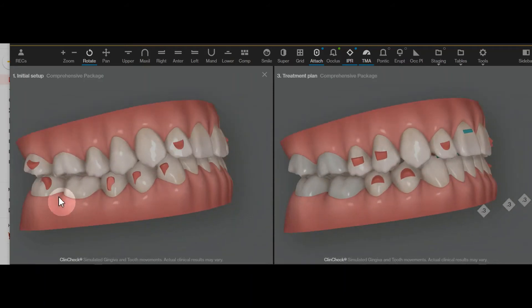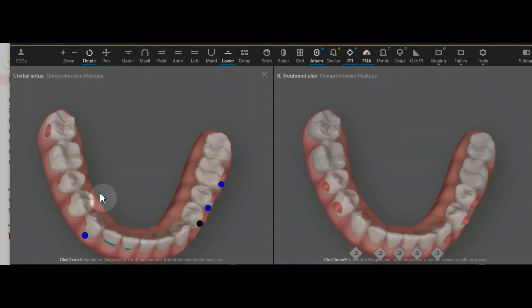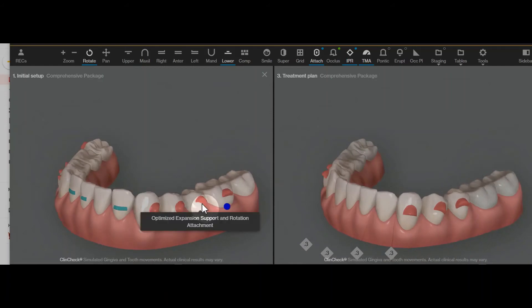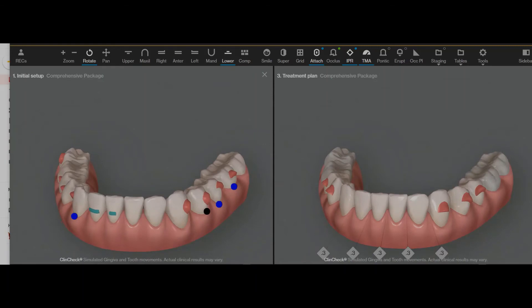The other changes I made were to eliminate molar movement that wasn't going to predictably happen. These molar movements, even with attachments — and these molars don't even have attachments — is not anything we can realistically expect to happen. Also, lower anterior intrusion typically doesn't happen unless you have very good retention attachments like these. Trying to move the premolars in a rotational or root torque type of way while trying to intrude is not something that's going to work out very well either.